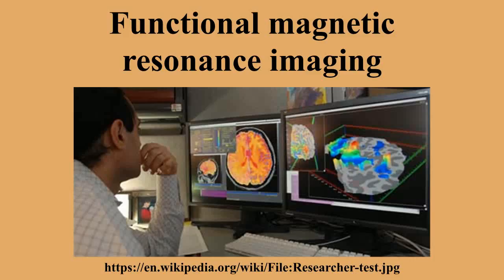Clinical use. Physicians use fMRI to assess how risky brain surgery or similar invasive treatment is for a patient and to learn how a normal, diseased or injured brain is functioning. They map the brain with fMRI to identify regions linked to critical functions such as speaking, moving, sensing, or planning. This is useful to plan for surgery and radiation therapy of the brain. Clinicians also use fMRI to anatomically map the brain and detect the effects of tumors, stroke, head and brain injury, or diseases such as Alzheimer's.